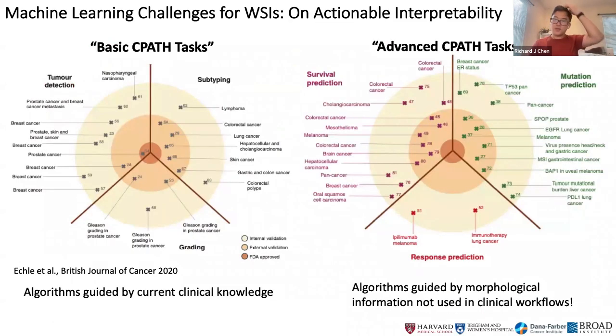Lastly, on the interpretability: in developing prognostication tools for tangible clinical translation, the goal for deep learning based survival outcome prediction is to not only perform better patient stratification, but also to use these models for potential biomarker discovery, specifically using model interpretability to elucidate novel morphological features not captured in current clinical readouts.